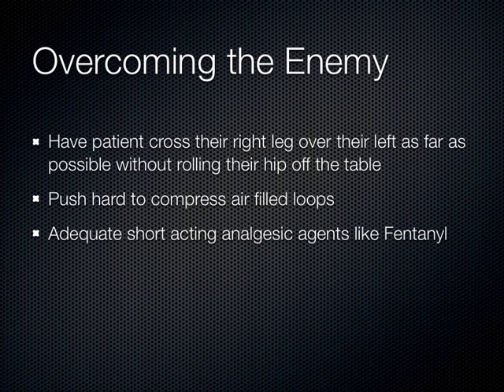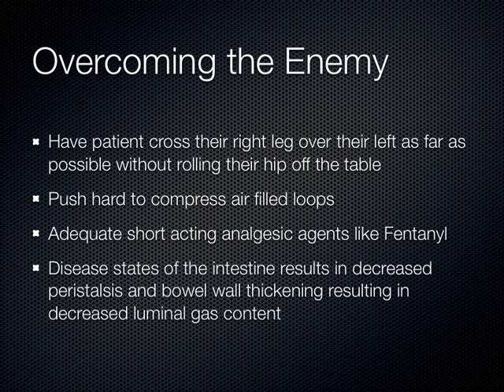People say ultrasound is a very operator-dependent thing. Some people are good at finding the appendix, some people aren't. No. Appendicitis is a very fentanyl-dependent thing. You guys know what fentanyl is, a narcotic, short-acting, lasts 20 minutes. We use it a lot in patients who have acute pain in the emergency department. I can give somebody a good slug of fentanyl, and it really does take the edge off their pain so that I can compress and get into their abdomen using ultrasound. It's a much more humane way to do it than what we're going to do today to our models.